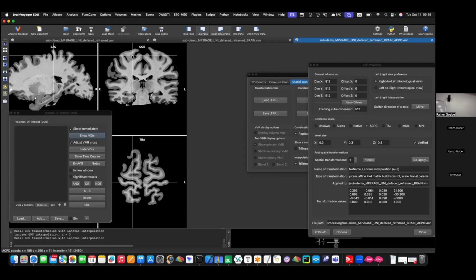And then you can also let it define the cube, but sometimes, for example if you align data, it's good. It knows the center is always the middle. So you can have any cube as long as the center stays the same, right? Why does it need to be a cube though? There are historical reasons. It's not really important. I will also remove this at some point. Sometimes it's good. Then you have one file and then you use the transformation file and you can go to space. Sometimes you need only a part.